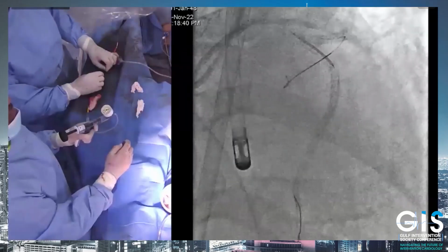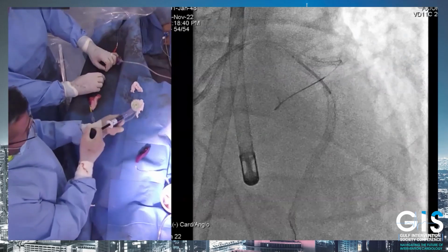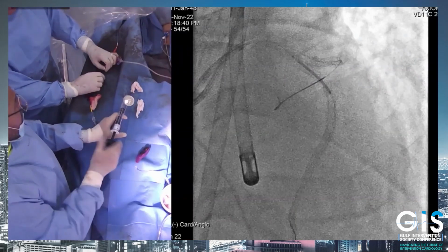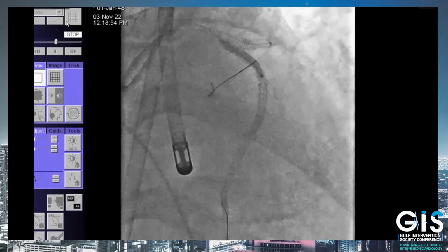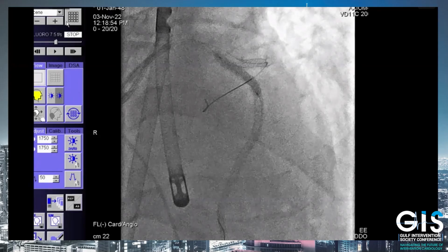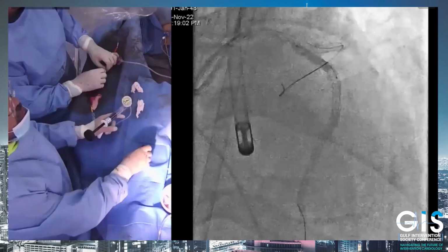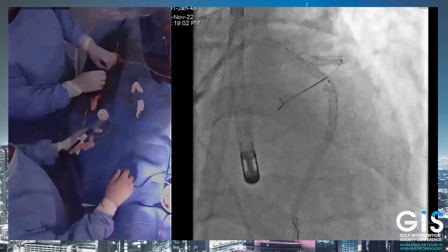All right? Agree, everyone? Okay. Let's go to 4, 6, 8, 10, 12, please. Another 4, please. 22. Okay. Yeah, go. It's open nicely. You see the impact of this? Go 12, 14. Down, please. So it's really helped us a lot to have a full good expansion, I think.